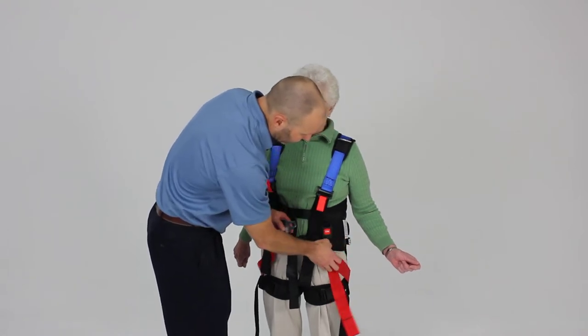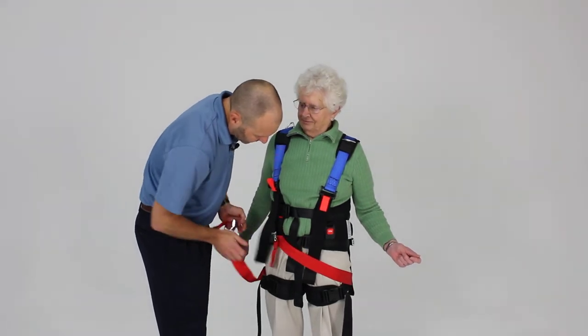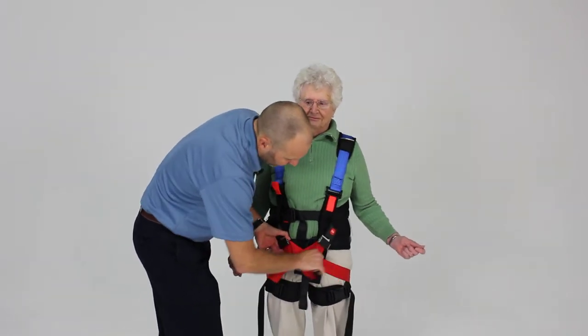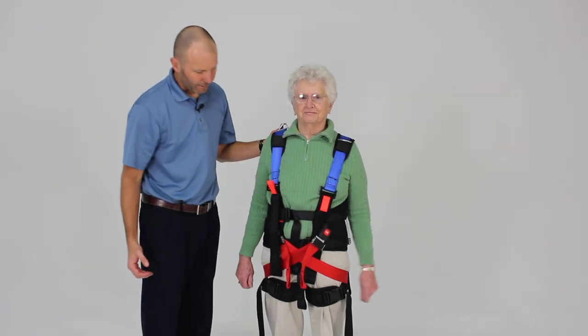So we're going to take these and then clip them, coming all the way across in front of the patient. Clip like so, and then clip like so. Then go ahead and take up our slack here. And now we've really captured that pelvis and it creates a nice tightening effect to the entire region.